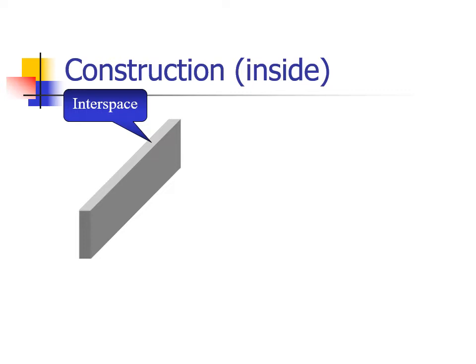This material must be radiolucent. Radiolucent materials allow X-rays to penetrate without stopping their passage. This is like glass, which allows light to pass through it unimpeded. Aluminum, plastic fiber, or paper are materials that are used to meet this requirement.